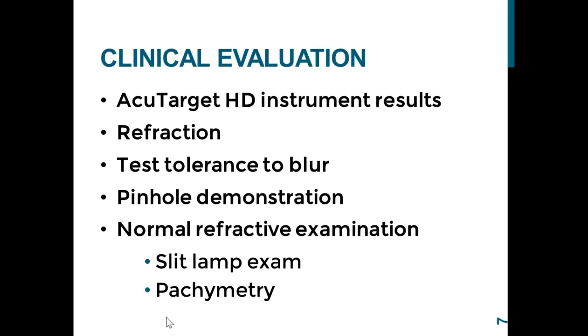I like to use the loose trial lenses. One thing to keep in mind is not using the phoropter because it really doesn't give them a good feeling. It gives them much more of a tunnel vision feeling than if you do either the trial frame or the loose lenses. If you're putting it in the trial frame, remember to make sure that that pinhole is centered on their line of sight. Otherwise, they're tilting their head up or down, and that doesn't give them a real good feeling of what it's going to be like.